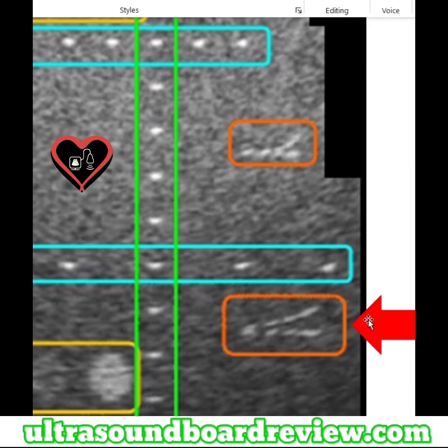And the more narrow the beam, like we talked about, the better you're going to see the space between those two structures. And then as we move further down, the pins are getting close together, you can see the space there pretty well, and then right there. And then right here is where you can't really see it that well. It looks like one structure. There's actually two structures, but you can only see one.